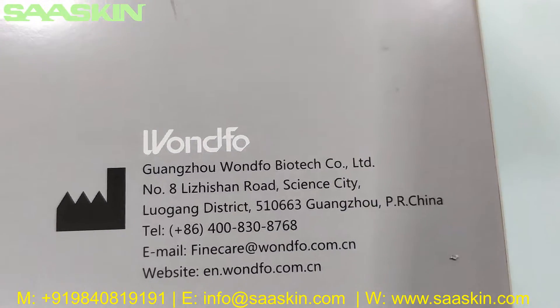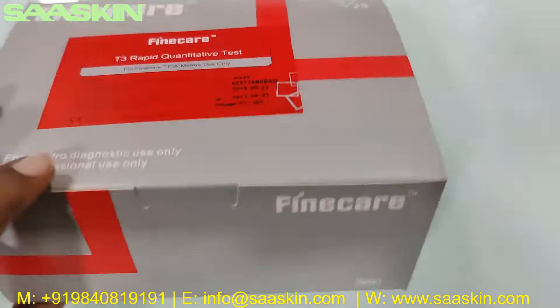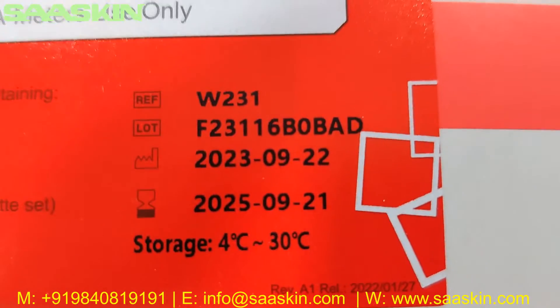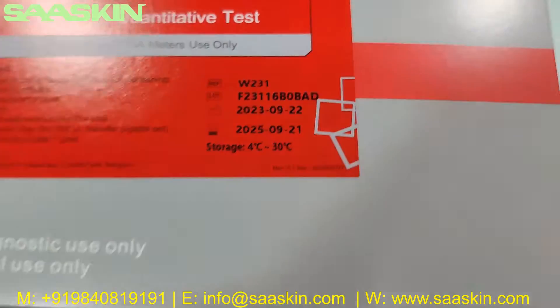This is from Wondfo FineCare and Guangzhou Wondfo Biotech Limited. On the box you can see the reference part number, lot number, manufacturing date, and expiry date. On a standard you have 2 years of expiry and the storage temperature is room temperature.